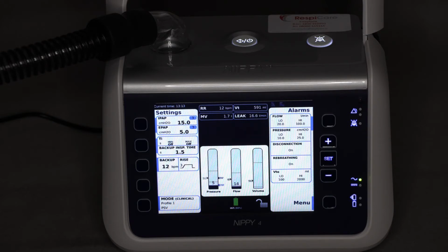Once your mask is secure, you can continue to use the ventilator through the night or as recommended by your prescriber. If the mask is not secure or tight enough, there may be some leakage around the sides of the mask or into the eyes. It's important to have little or no leak from the mask.